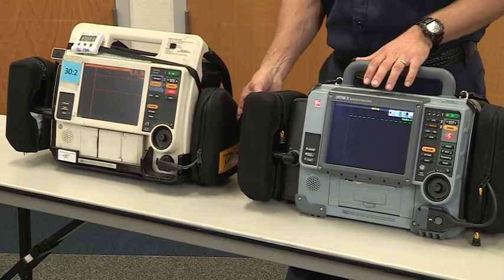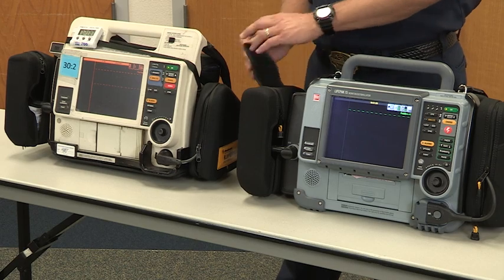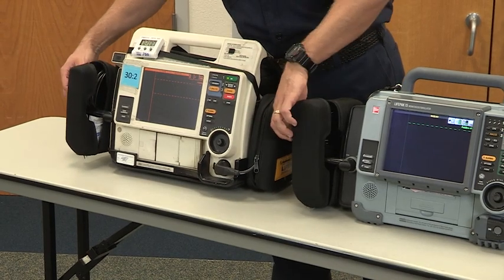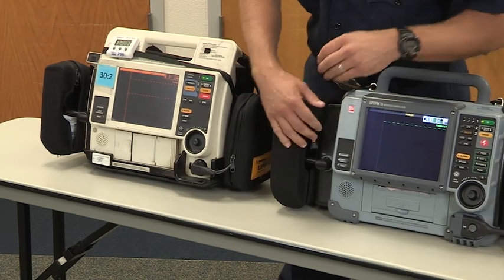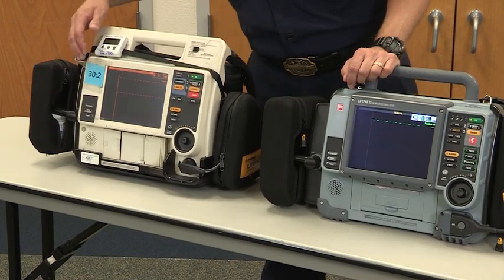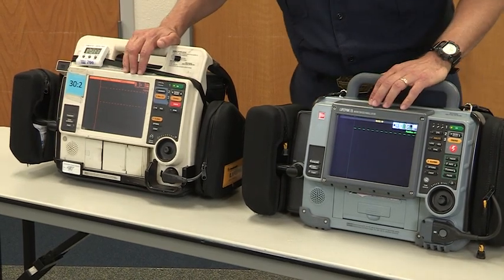One of the differences you'll notice on the outside patch of the 3-lead cable pouch is a wireless transmitter on the LIFEPAK 15. 3-lead cables are located in the same pouch on either machine. You'll notice that a transmit code summary and print button are also located in the same location on the LIFEPAK 15 and the LIFEPAK 12. You'll notice that there's a color screen on the LIFEPAK 15 versus a single color on the LIFEPAK 12.